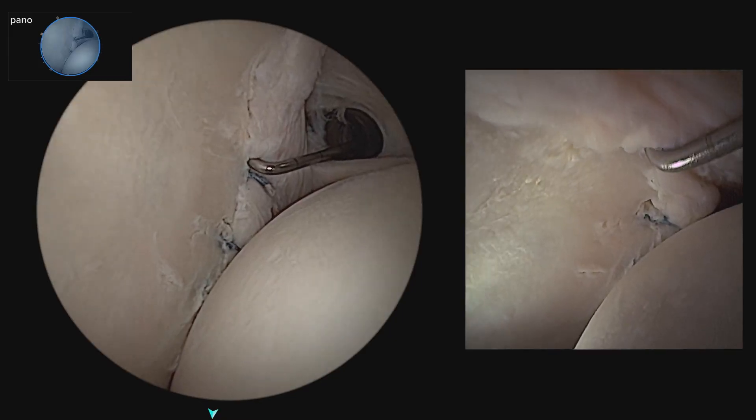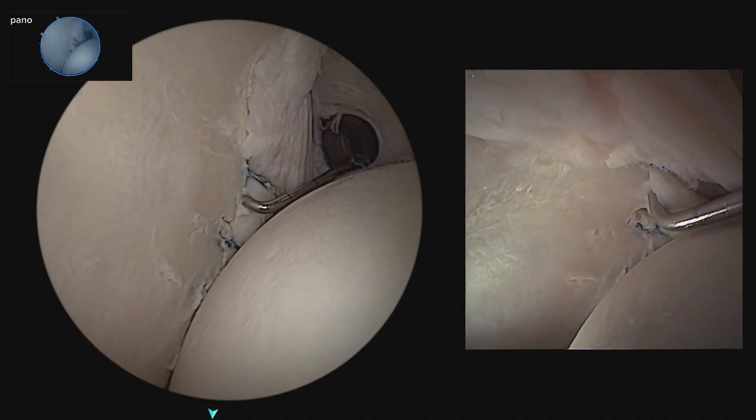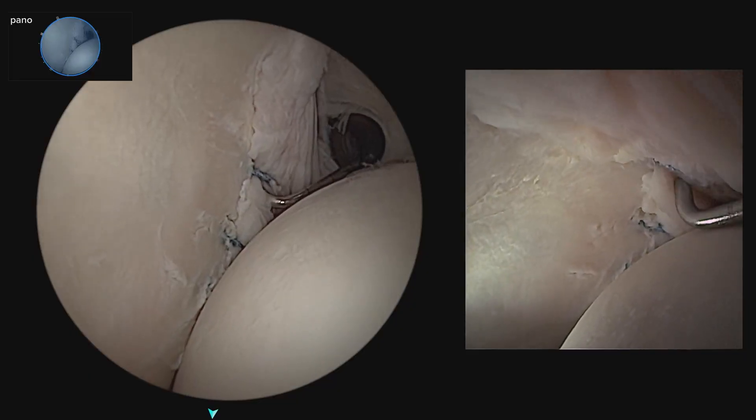Hi, I'm Dr. Jonathan Roth from Wayne, New Jersey, and today we're going to go over the simultaneous viewing technique of a Bankart and remplissage using the nanoneedle and panoscope.